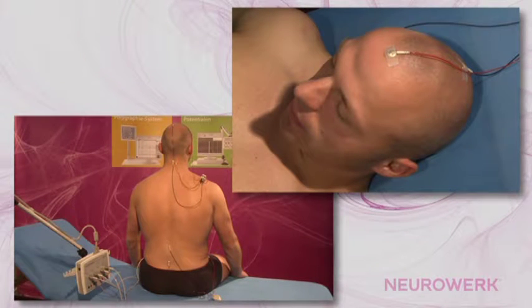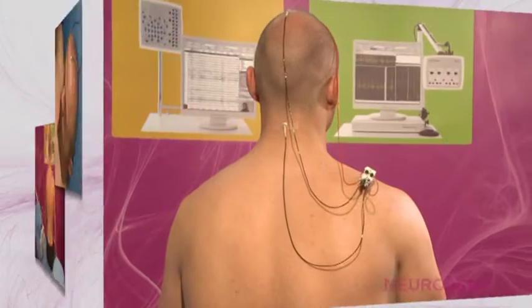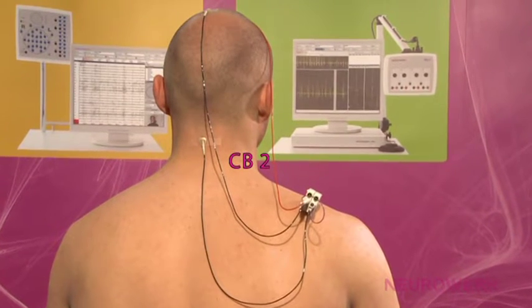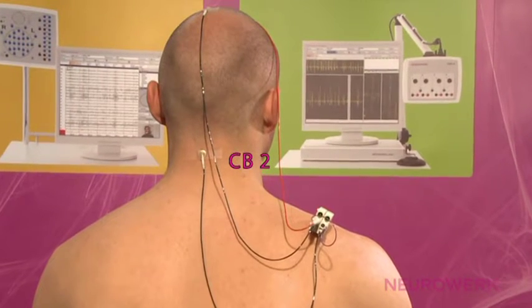4 different or active electrodes are placed in the 4-channel SSEP recording of the tibial nerve. Channel 1 corresponds to the electrode position Cz', which is located 3 cm in the posterior direction, which means occipitally, starting from the Cz central point. The CB2 spinal recording place is used as a second channel, wherein the surface electrode is applied 4 to 5 cm below the inion by using adhesive conductive paste.